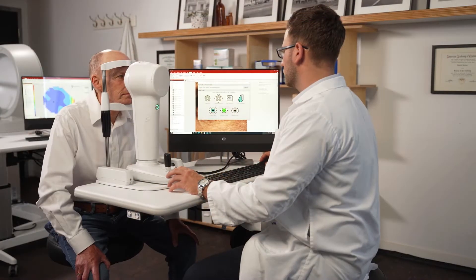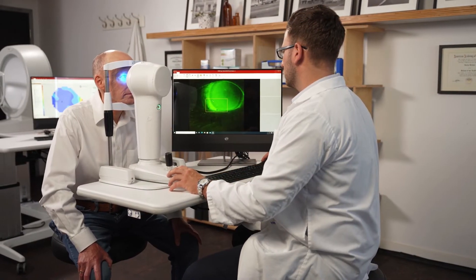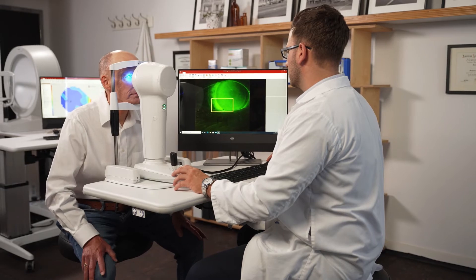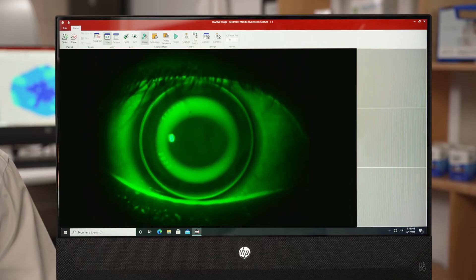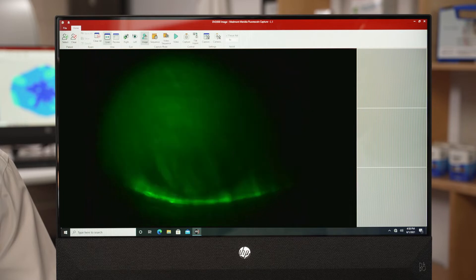Similarly, your Medmont Meridia can perform fluorescein imaging and video of both the ocular surface and to evaluate and document rigid lens findings.